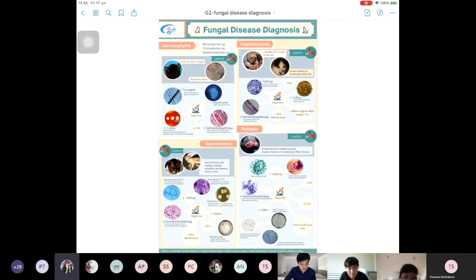Okay, thank you. And in terms of false positive or false negative for dermatophytes, mostly we found false negative from infection with Trichophyton, and Trichophyton cannot give a positive with Wood's lamp, because most of these members cause endothrix infection.